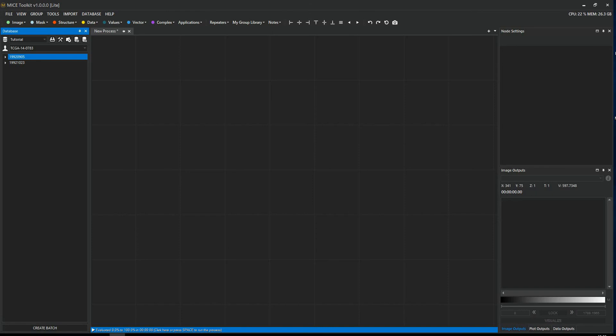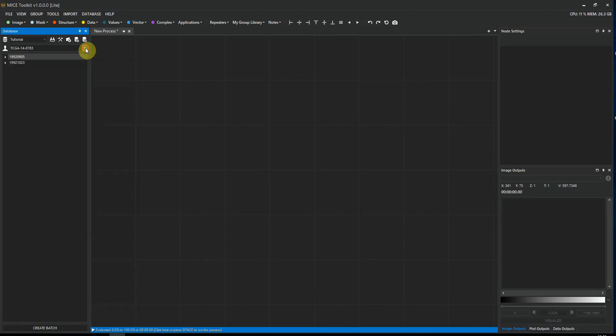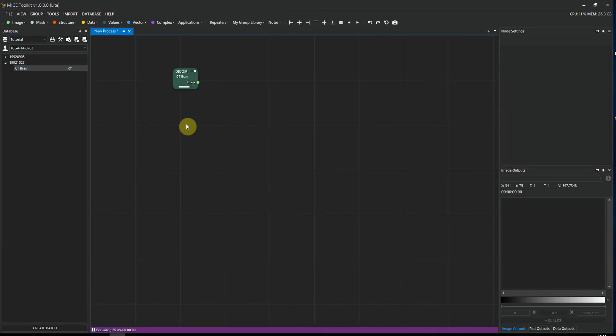As a first step, let's go ahead and load some data into this empty workspace. Usually, you will access data through databases, and the database panel can be found on the left. So here, you select which database we are using. In this drop-down menu, you can select the patients in the specific database. And then here in this panel, you can see all the exams and images connected to that patient. So I'm going to load a CT image into the workspace. I'm going to do that by selecting this CT image here and drag and drop it into the workspace. To load the image, I will press spacebar to execute the workflow.